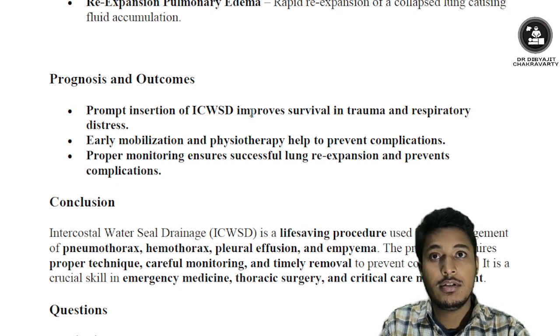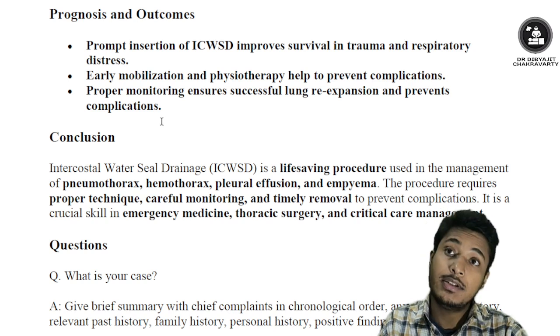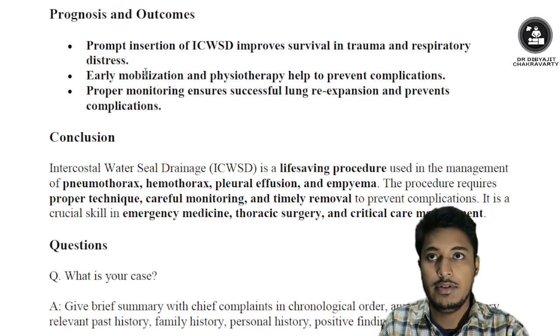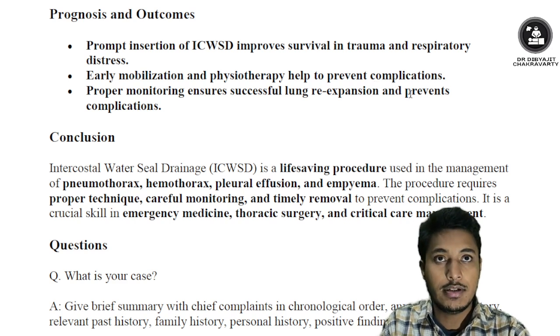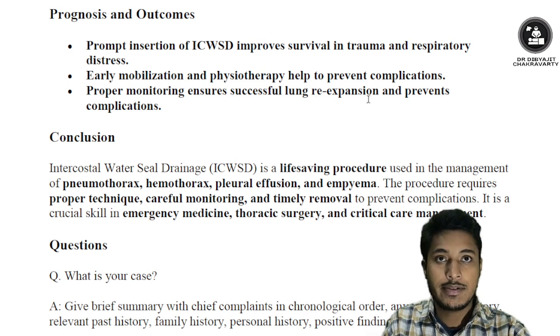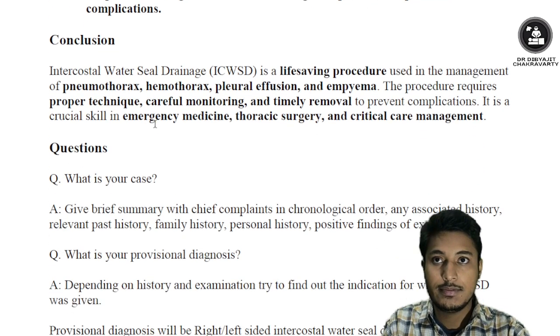Insertion of an intercostal water seal drain improves survival in trauma patients and in patients with respiratory distress. Also, it helps in resolution of the pathology of the pleural cavity. Early mobilization and physiotherapy also aid in preventing complications of the intercostal water seal drainage system. Proper monitoring ensures successful lung re-expansion and prevents complications.